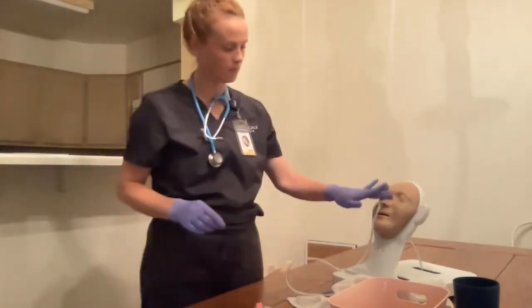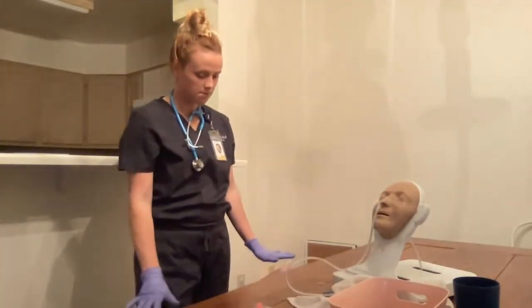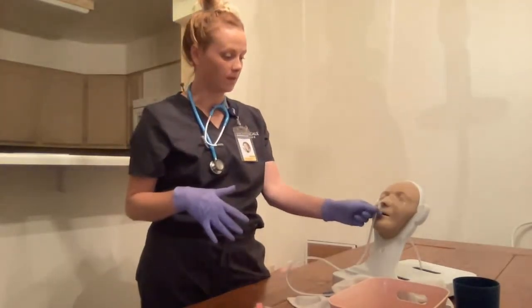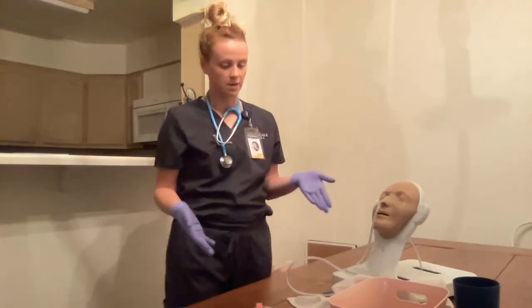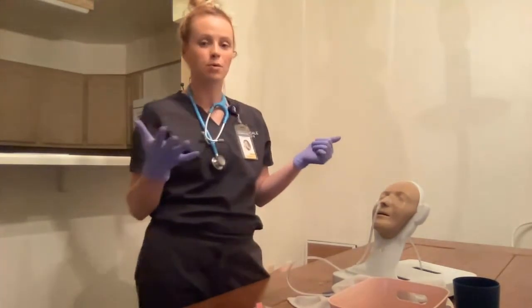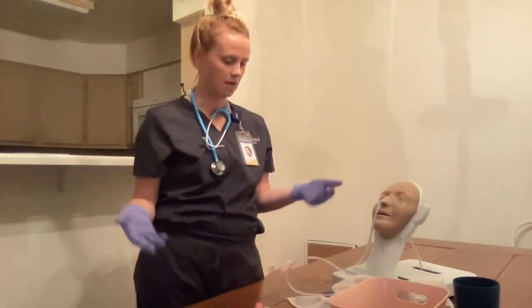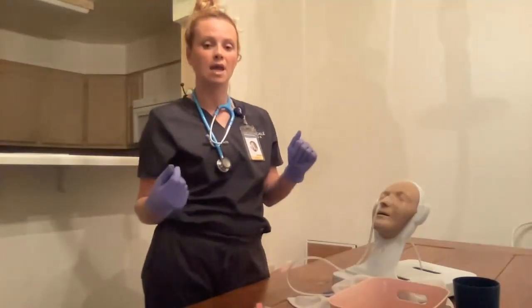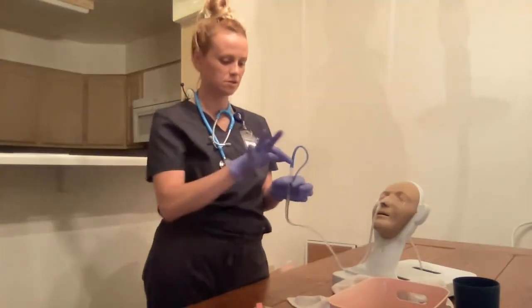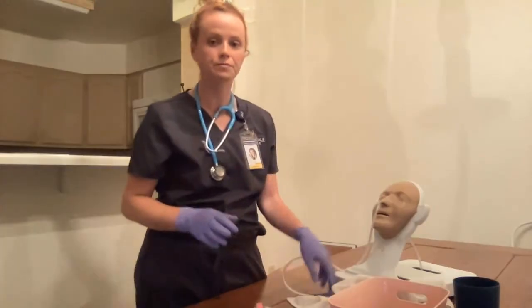There we go. All right, at this point, I would lower the bed and confirm with x-ray. X-ray will come to her room and verify that it is in the correct place. X-ray has come. It is in the correct place. At this point, if the physician had ordered suction, he didn't, but if he had, I would set everything up and ensure that everything is closed properly. He didn't order the suction, so I'm just going to make sure the clamp is closed properly.